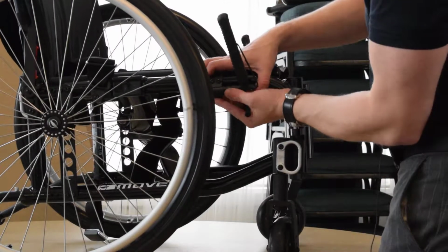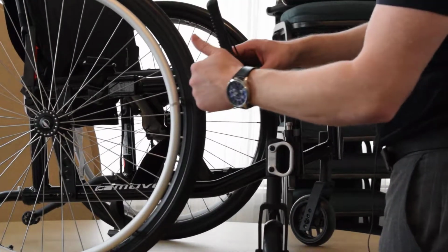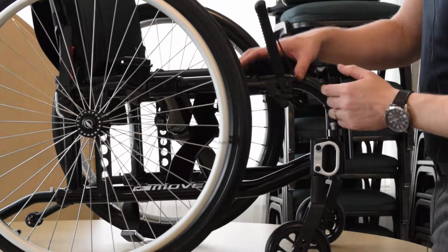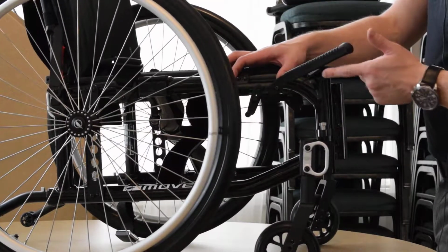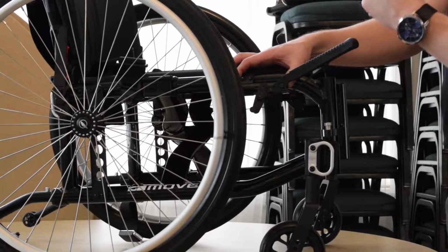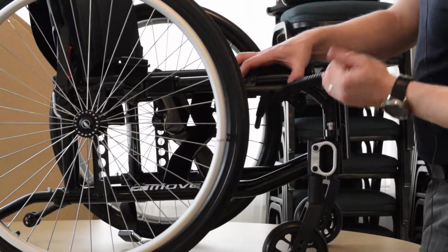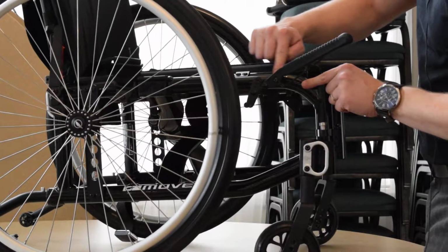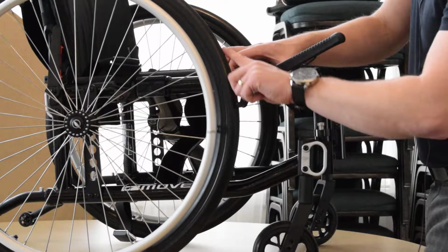Now, in order to get a good amount of bite on the tire, we're going to want to use about 1/4 of an inch of adjustability or movement there to achieve that. So what I'd like to do is engage the wheel lock fully, simulating as if you're engaging the wheel locks fully. So you can see that it's all the way engaged there. And then from there, I'm going to push on this portion of the rail just so that this portion here butts up nice against the tire.